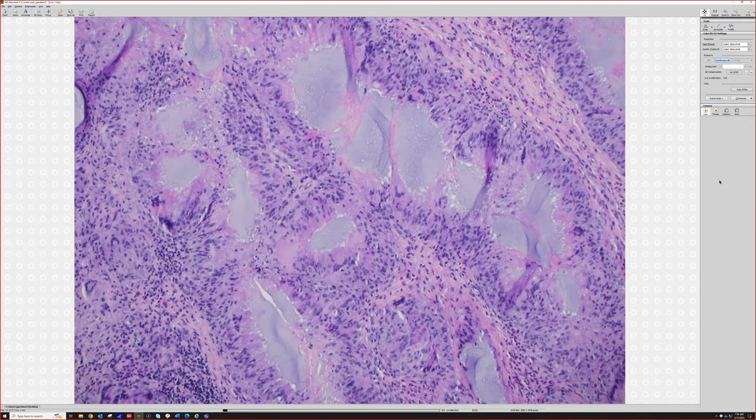So yeah, this is filler. And what type of filler? There's a lot of different fillers, and the best way to know is the history, but this is the one filler that I think is pretty recognizable, actually, because it looks like something that naturally occurs in our body.